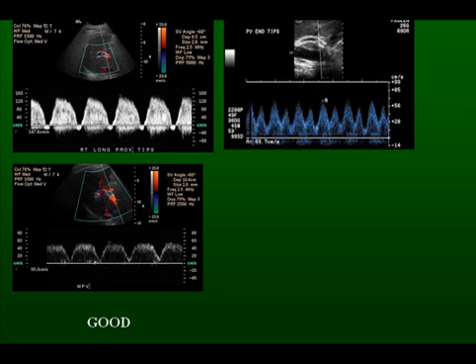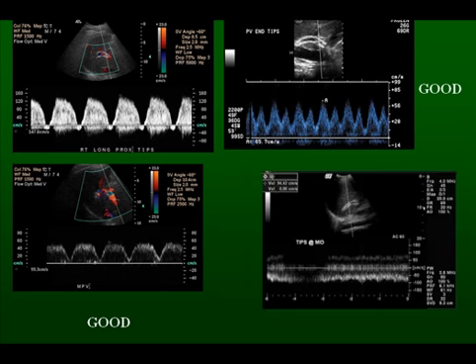This is a TIPS where you see the cardiac pulsation, and later on the monophasic flow, or the flat line flow in the TIPS, which indicates shunt dysfunction. So this is bad. If you see a monophasic flow in the setting of abnormalities of the other indices, you should suggest shunt dysfunction.